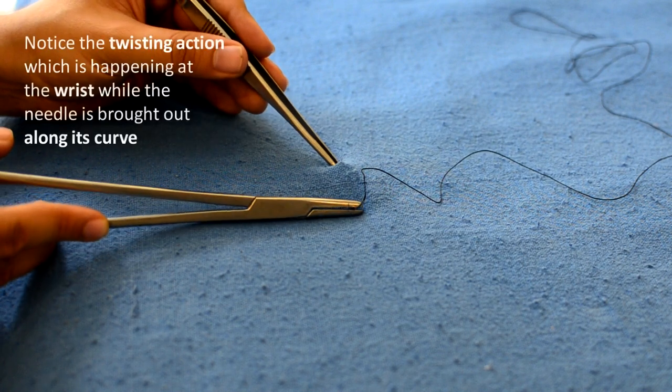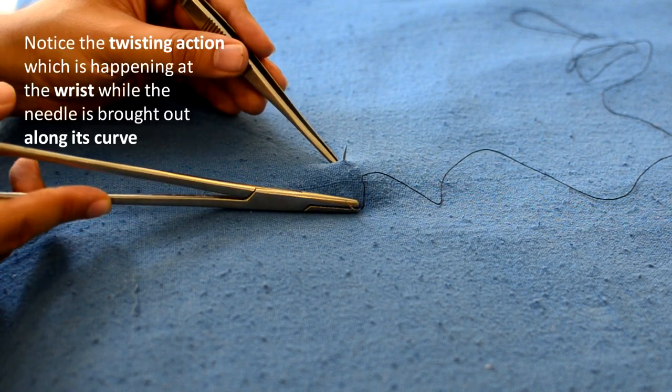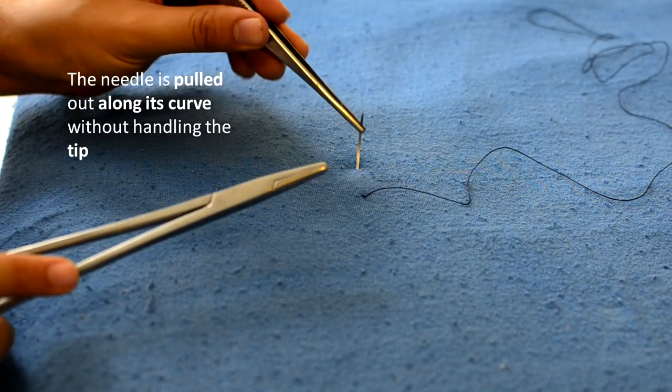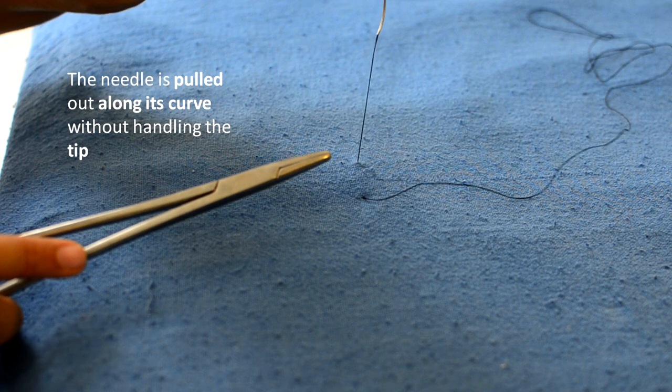Just notice how the wrist is twisting and following the curve of the needle. While pulling out the needle, again the curve of the needle is followed and the tip is not to be handled.